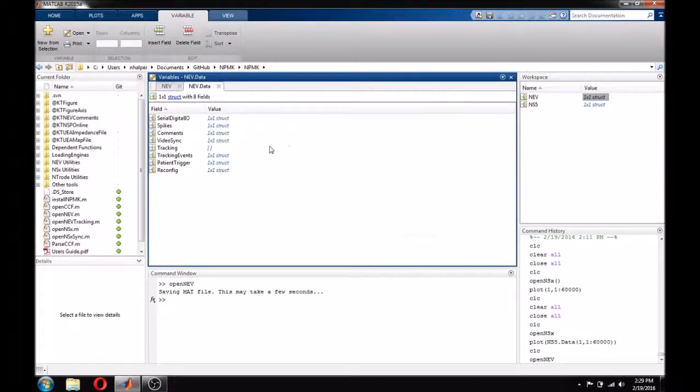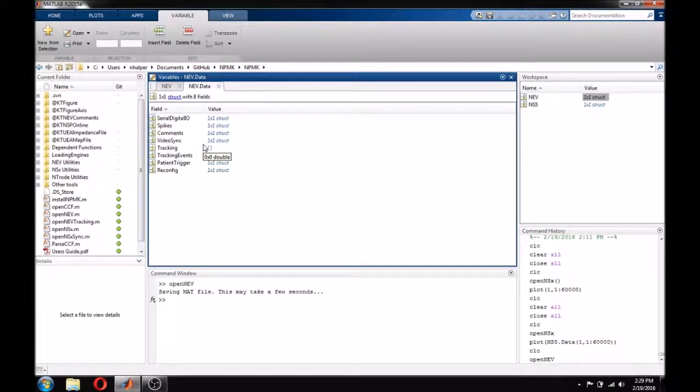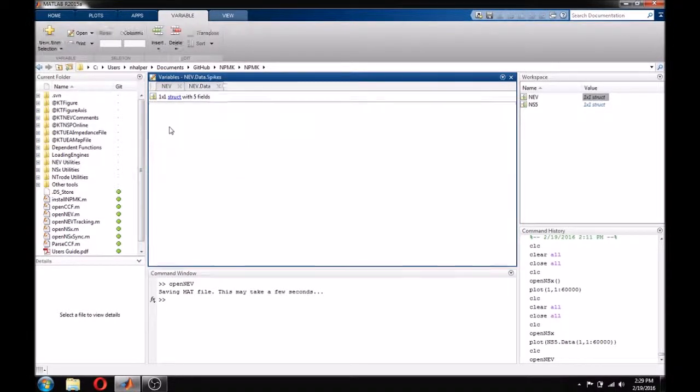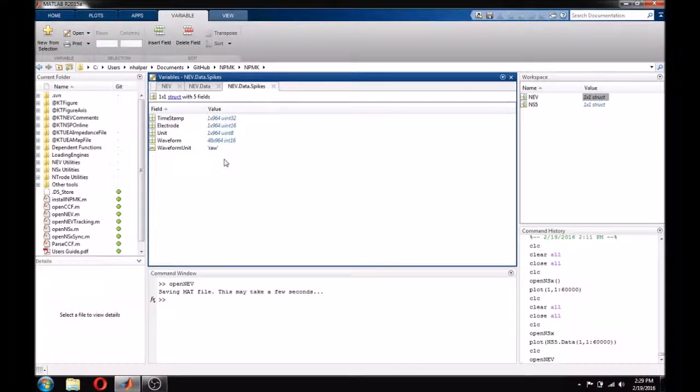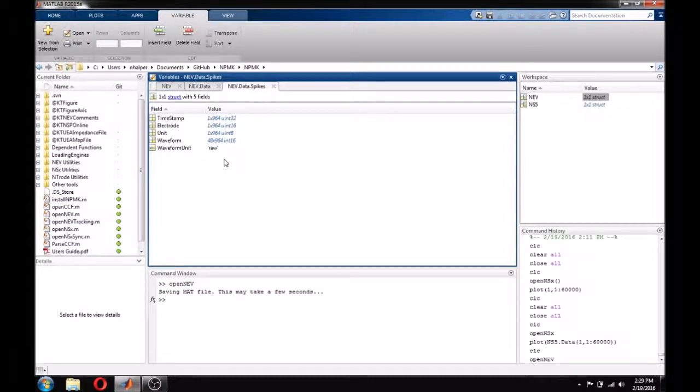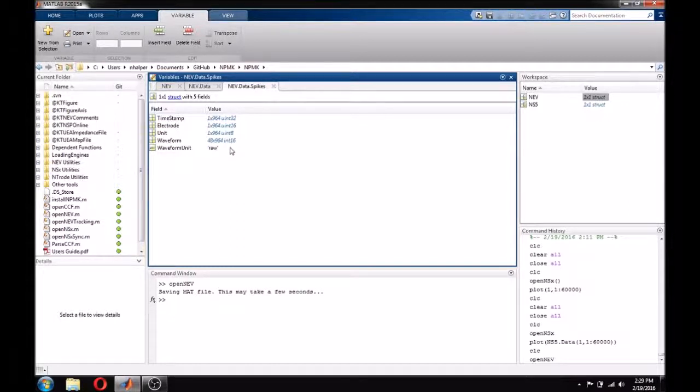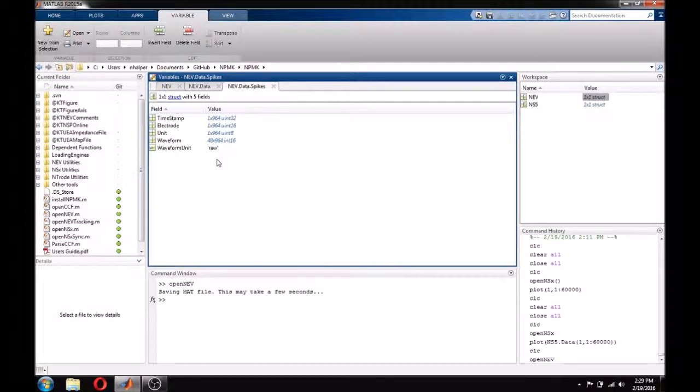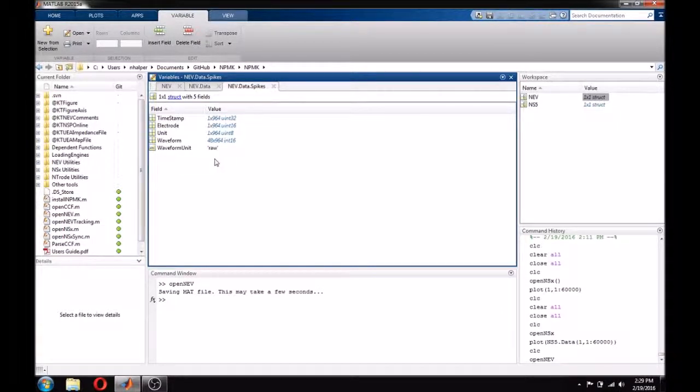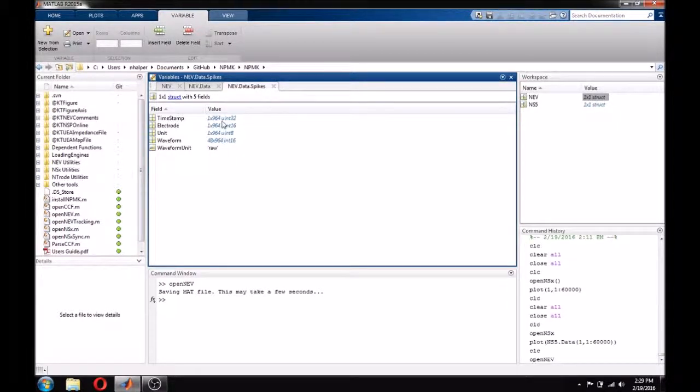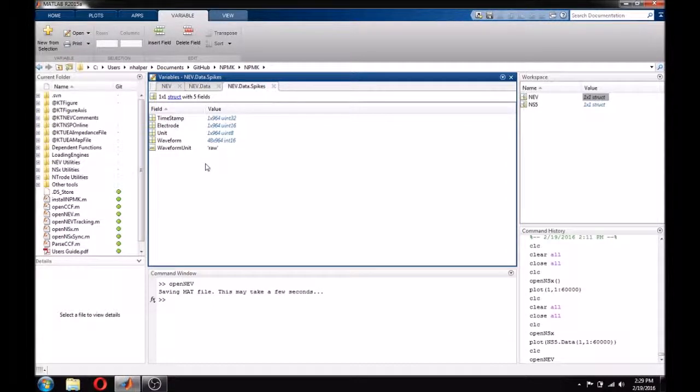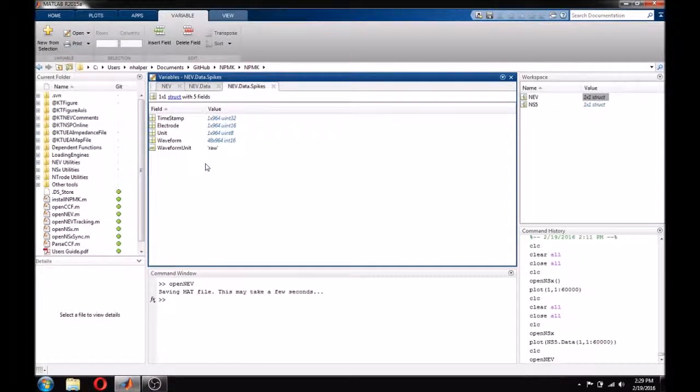To get an idea of how each of these fields are organized, let's look at the spike data. For any given spike, there are a few pieces of information that we can associate. The timestamp at which the spike occurred, the electrode on which it was recorded, the sorted unit that it is assigned, and the actual waveform itself. The way that this structure is organized can be seen in the length of each matrix. Each of these fields has the same number of columns, because each column represents all of the information about a single spike.